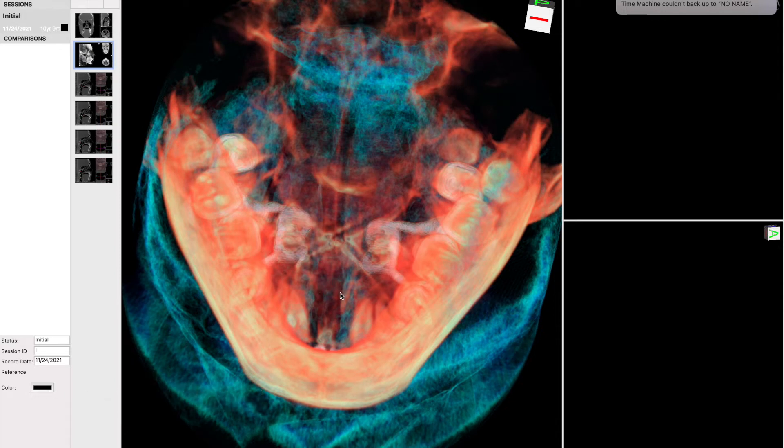As you can see, it's almost 8-9 millimeters of suture opening, and this is the A-point here. As we can see throughout the whole suture — from the front to the back area to the molar area — it's almost a parallel expansion both in the anterior and posterior regions.